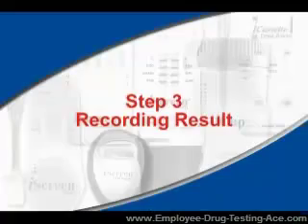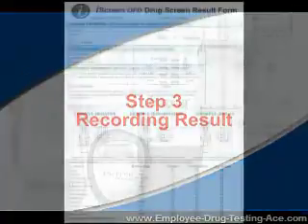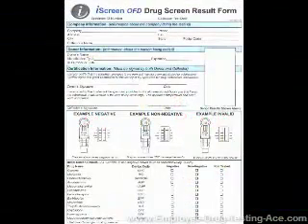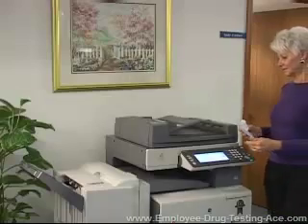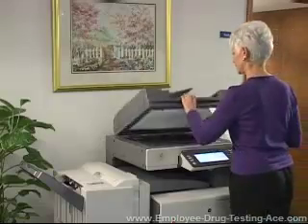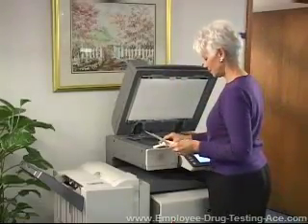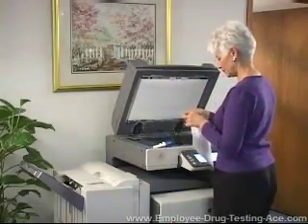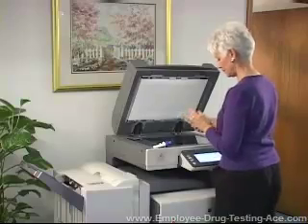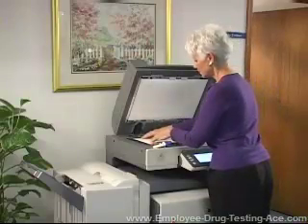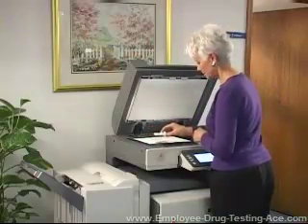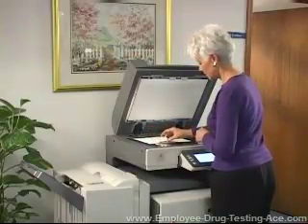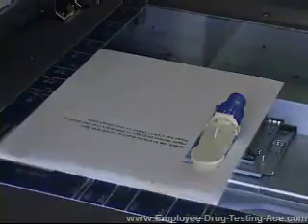Step 3: Recording Result. Each box of iScreen OFD devices comes with a photocopy template. To use the template for recording results, place the copy template face down on the scanner bed of the copy machine and place the pre-run iScreen OFD over the opening on the copy template. Then press Copy.